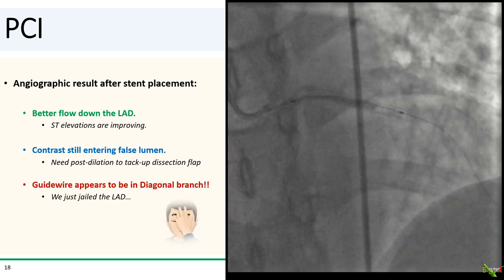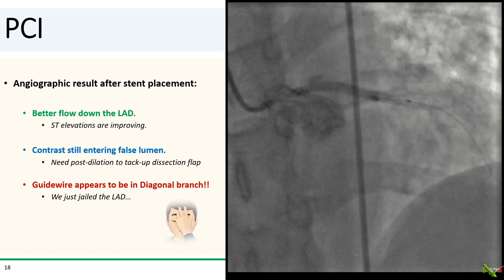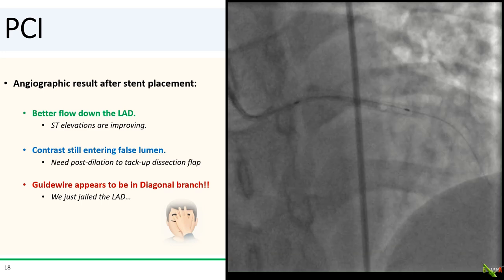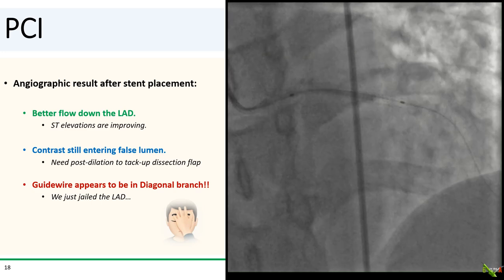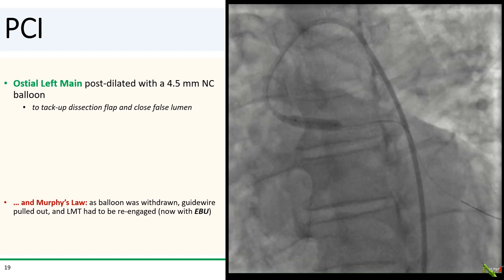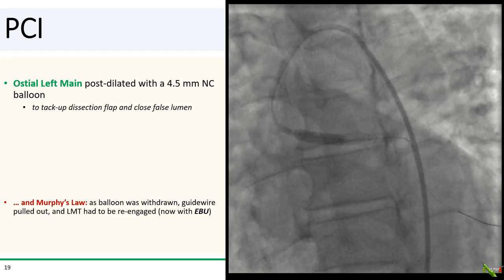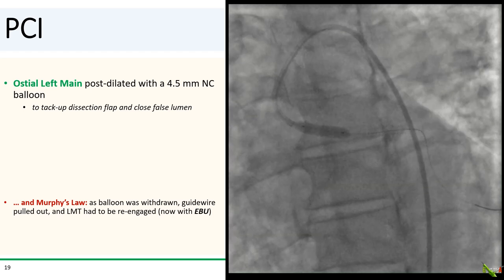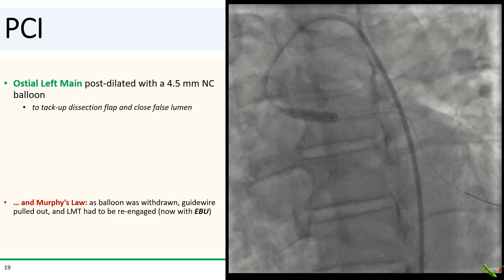But looking at this more carefully, your heart just sinks into your stomach. It does look like the guide wire is actually not in the LAD, but in a large diagonal. This case just keeps getting better — the stent just jailed the LAD. To better tack up the dissection flap, the ostial left main was post-dilated with a 4.5 mm NC balloon. And of course, there's Murphy's Law — as that balloon was being withdrawn, it dragged the guide wire along with it, and guide engagement was lost.